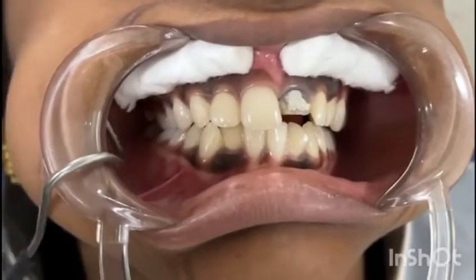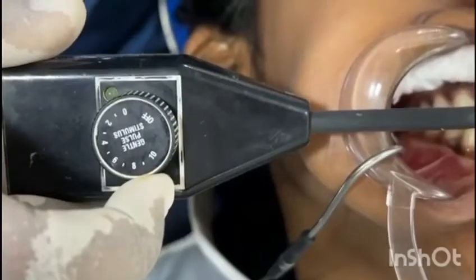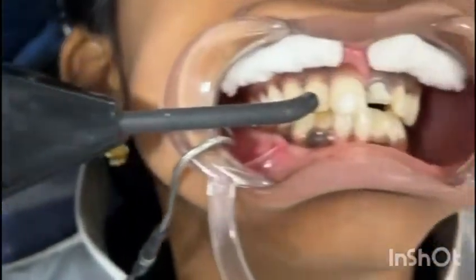The lip clip should be placed inside the patient's mouth. As an electrolyte, toothpaste is applied on the labial surface of the tooth to be tested. Then the rheostat is slowly increased.